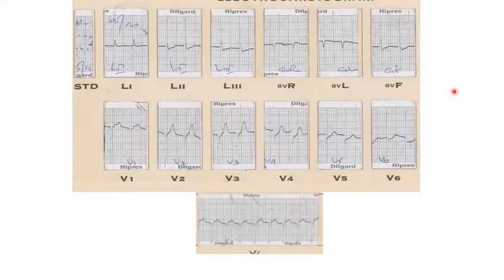See, usually in AVNRT, the P is inside the QRS complex, or maybe just outside the QRS complex, indicating that the RP interval is practically zero or short, and the PR interval is quite prolonged. But on the other hand, in patients with atypical AVNRT, sometimes the PR interval can be shorter than the RP interval, or it may be equal, or the P is outside the QRS complex. And what is the explanation? Anybody?